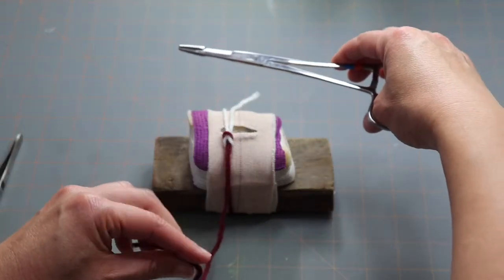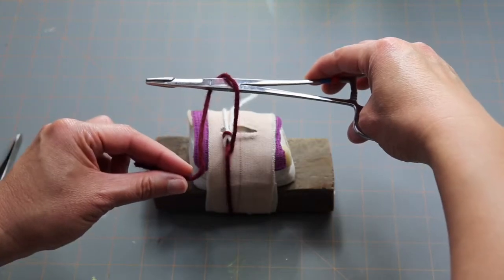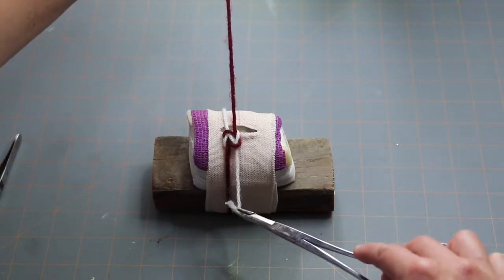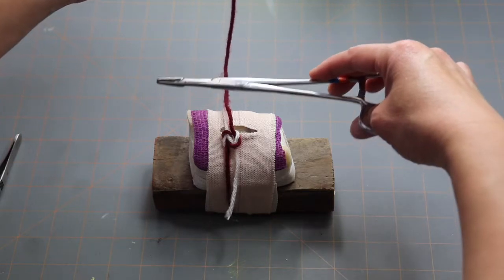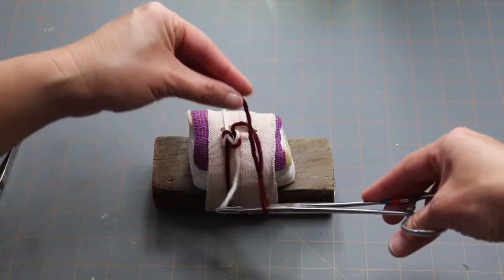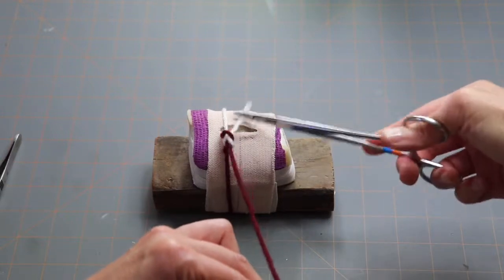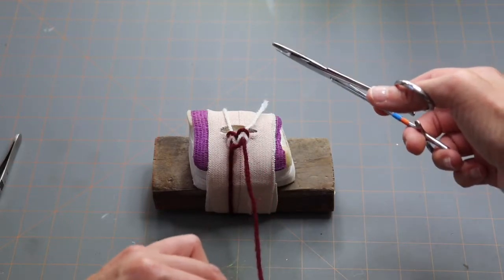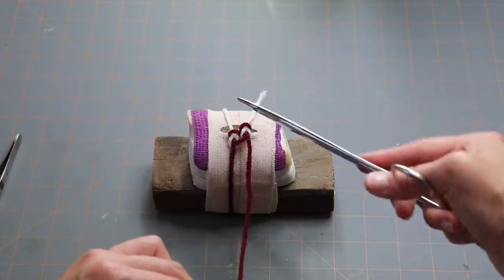Throw number three is the same as the first one. Keep your needle holders over your incision, wrap your maroon suture around the needle holder, pick up the white suture, and move your hands opposite each other. Nice flat knot. Throw number four: same thing — keep your needle holders on the inside, wrap the maroon suture over the needle holders, come down, pick up the white one, and move your hands in opposite directions, pulling with equal tension. There are two square knots right here. Ideally when suturing, tighten after every single throw to make sure it stays and won't slip out. That's how you do your throws.